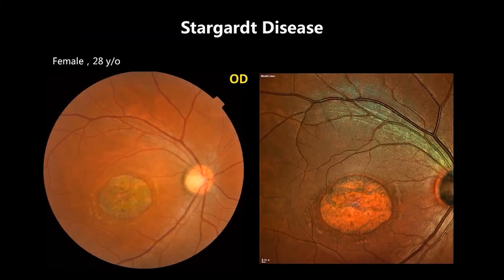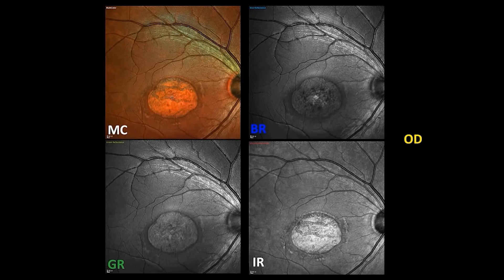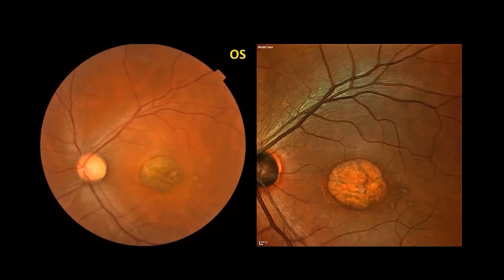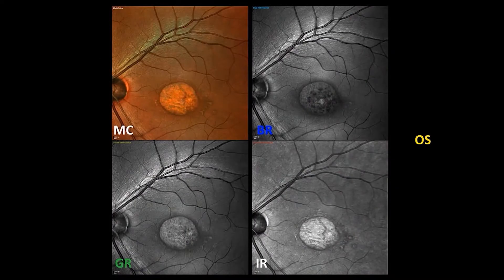In Stargardt's disease, both color fundus photo and multicolor showed macular atrophy with a beaten bronze pattern. Multicolor and other reflectance images demonstrate different structural changes on the macular lesions. OCT showed remarkable loss of outer retinal structure and very thin fovea. The same changes are present on the left eye.